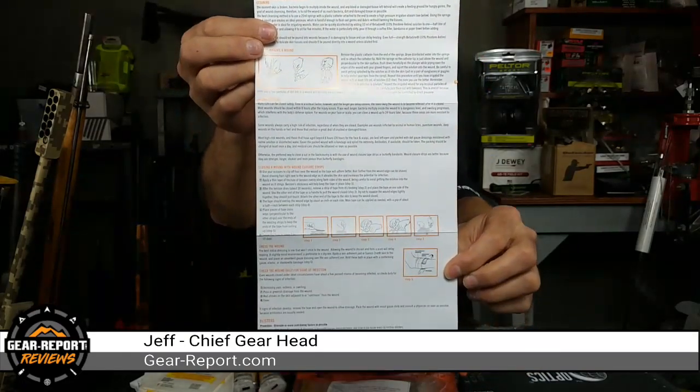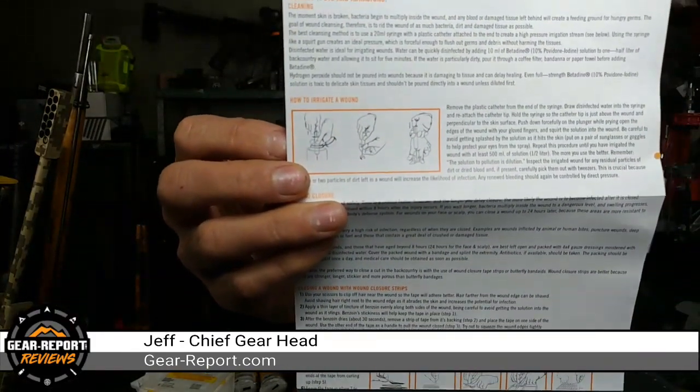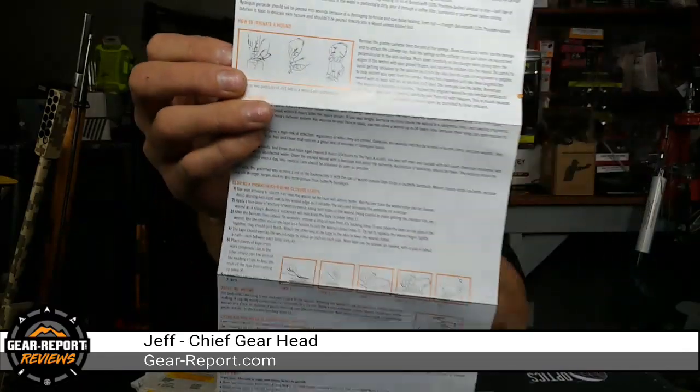And then this, you know, I'm finding this really cool that in each pocket they have, again, more information on how to use the different things that are in here. See the front and back here. Lots of instructions on how to use things, how to use the irrigation syringe. They show someone pulling water out of a Nalgene to, you know, squirt the debris and stuff out of a wound. There's one on here for wound closure. They have little diagrams for that.